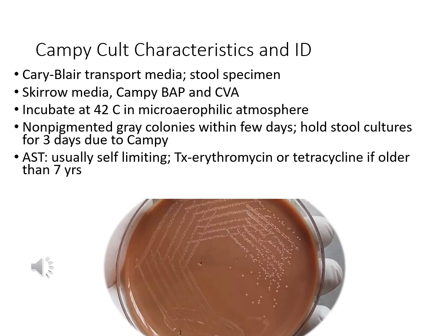Because of that, you will hold stool cultures for 3 days because Campy takes that long to grow. So sometimes you won't get anything the first 24, 48 hours at all. So you have to wait that 72 hours to be able to see if you have Campy or not. And then remember, with stool cultures, we're always ruling out Shigella, E. coli, and Campylobacter at all times. Again, most of the time, the symptoms are self-limiting. However, if the patient does require treatment, erythromycin or tetracycline will work if the patient is 7 years or older.